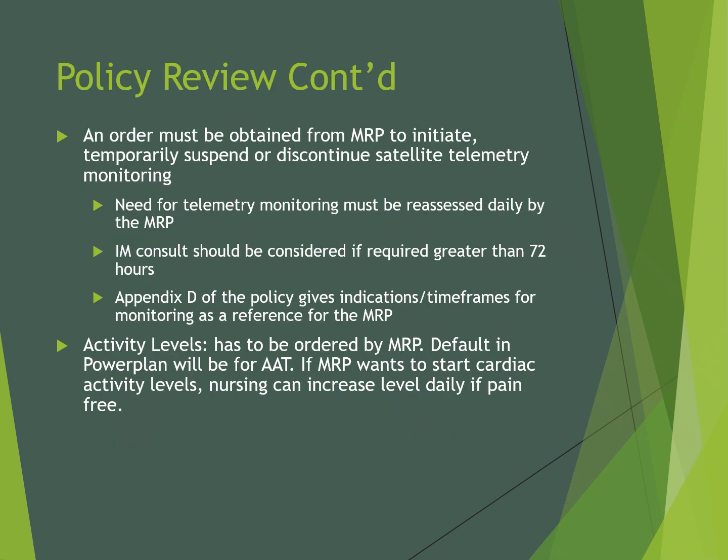The MRP must give an order to initiate, temporarily suspend, or discontinue satellite telemetry monitoring, and the need for telemetry monitoring must be assessed daily by the MRP. If the patient is on satellite telemetry monitoring for greater than 72 hours, it is recommended that an IM consult be considered.